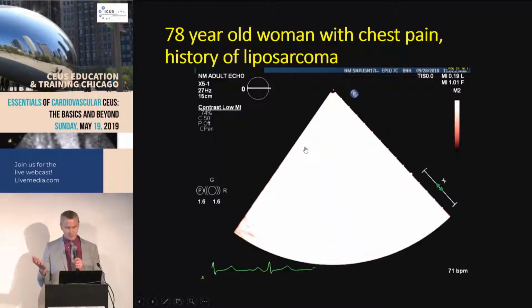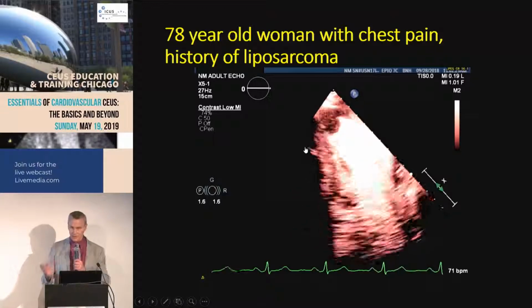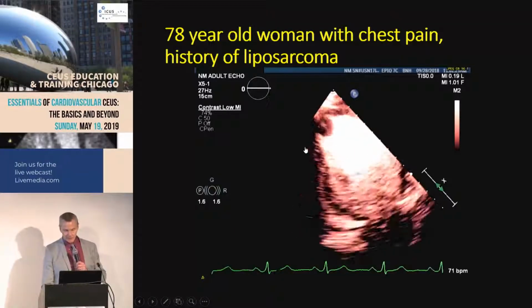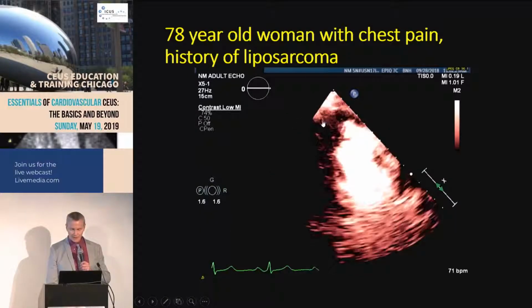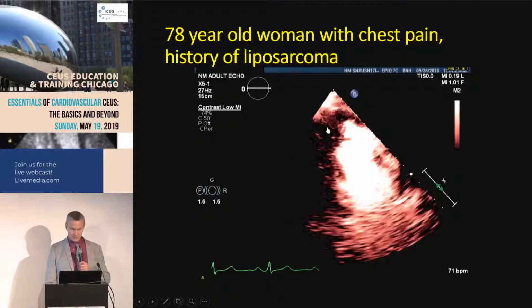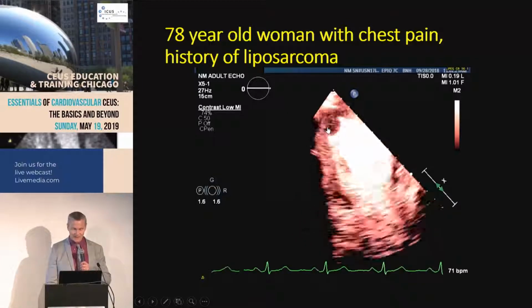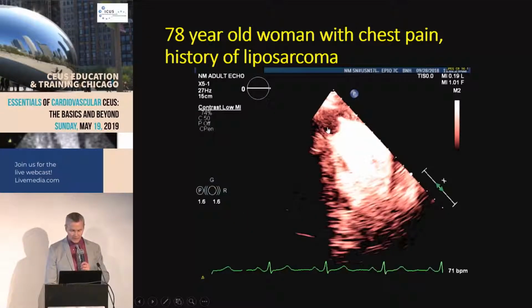Well, usually in thrombus, you'd expect to see a wall thickening abnormality with it, right? And that's the one thing as we're transitioning now a little bit from wall thickening to perfusion. One of the things with those high MI impulses, we can apply those and see what happens to the replenishment within here. Is there any contrast? A thrombus is not going to have any contrast in it, right? What does this have? It seems like it picks up a little contrast there. And the best way to do this is to use a triggered end systolic frame just to see that. But if you look at this, there's dark. And then if you look there, it looks almost like the myocardium, right?